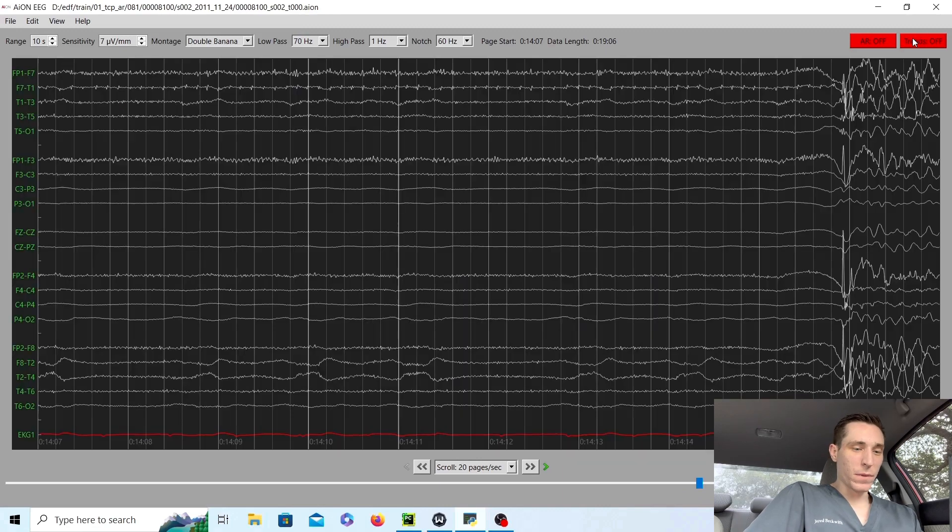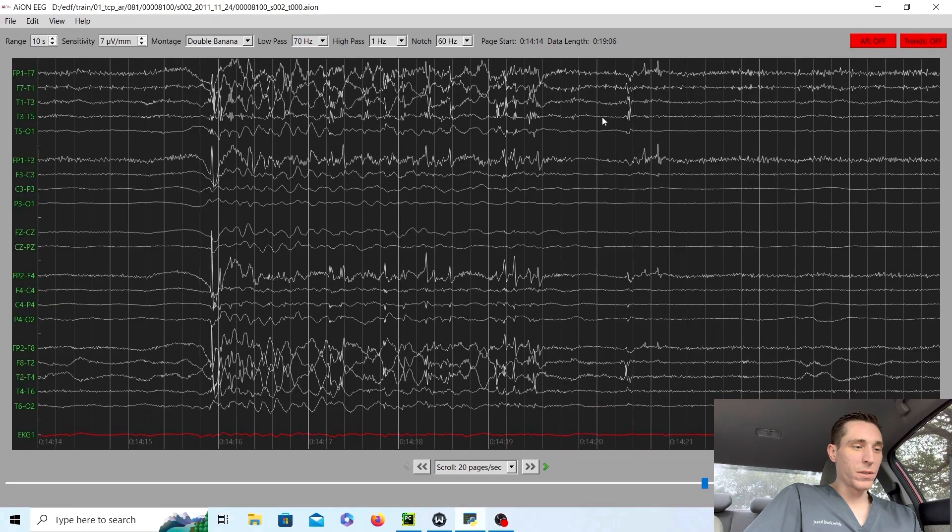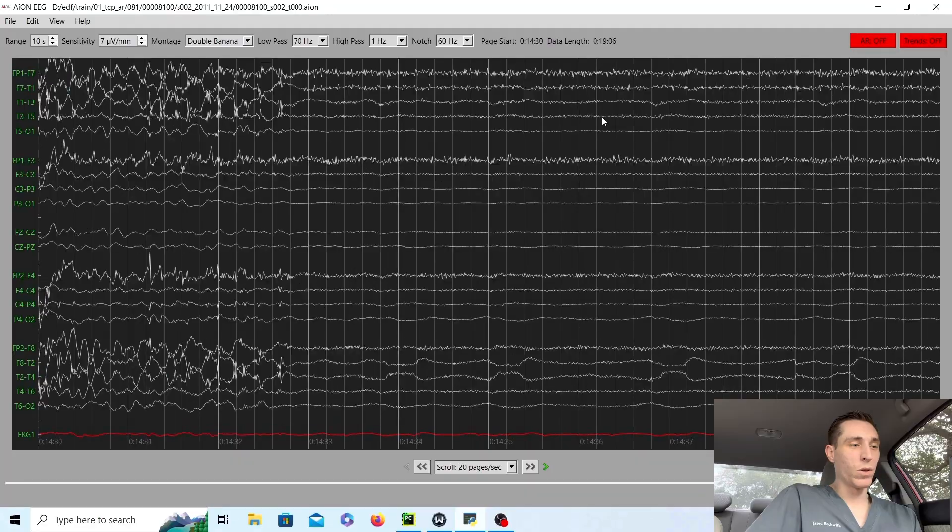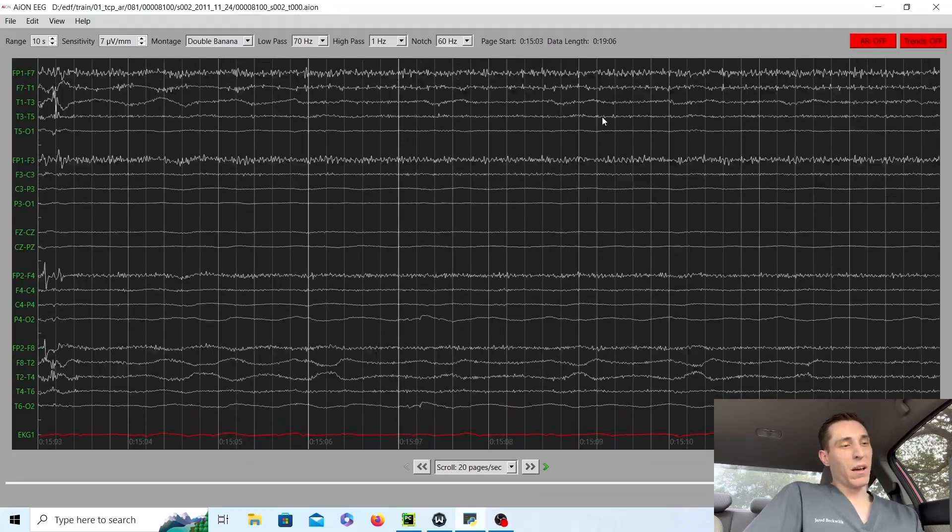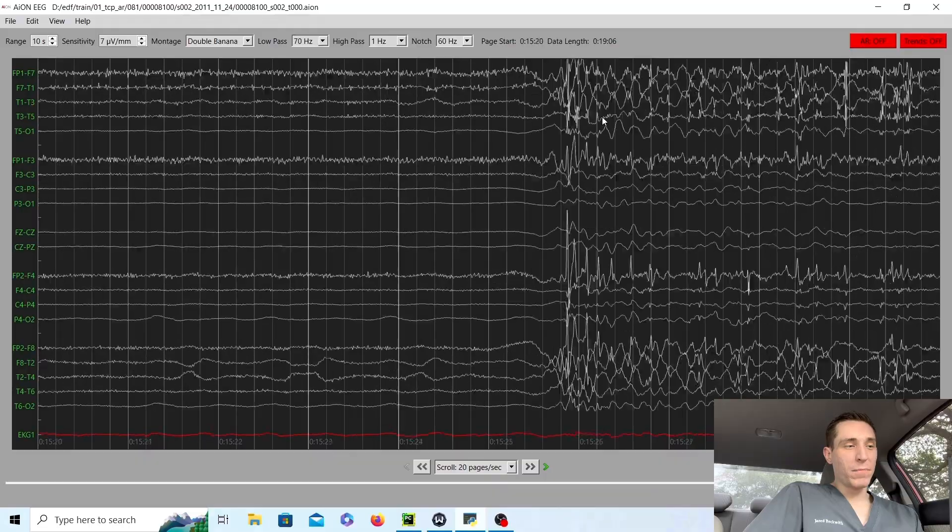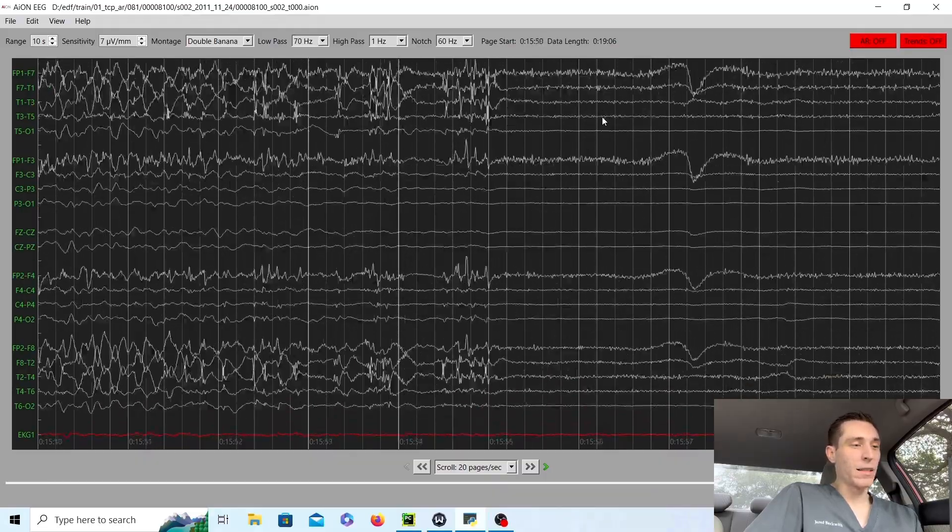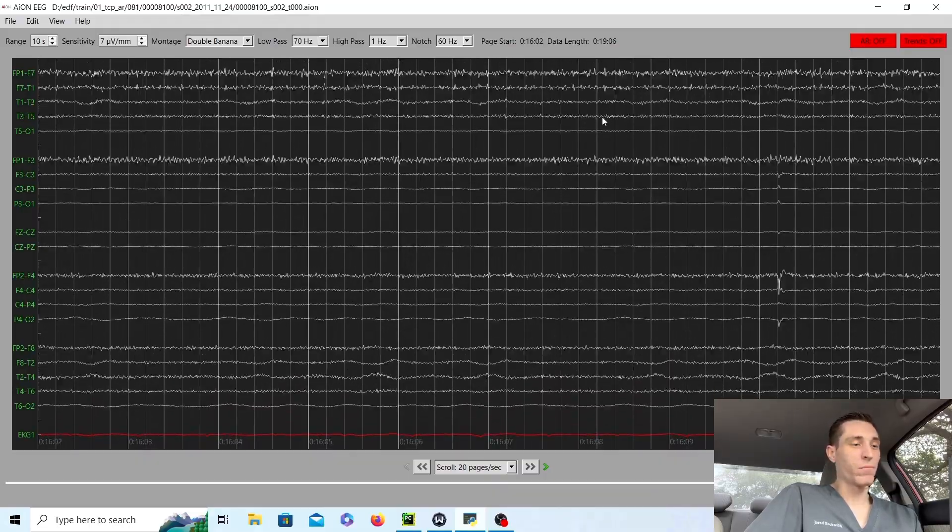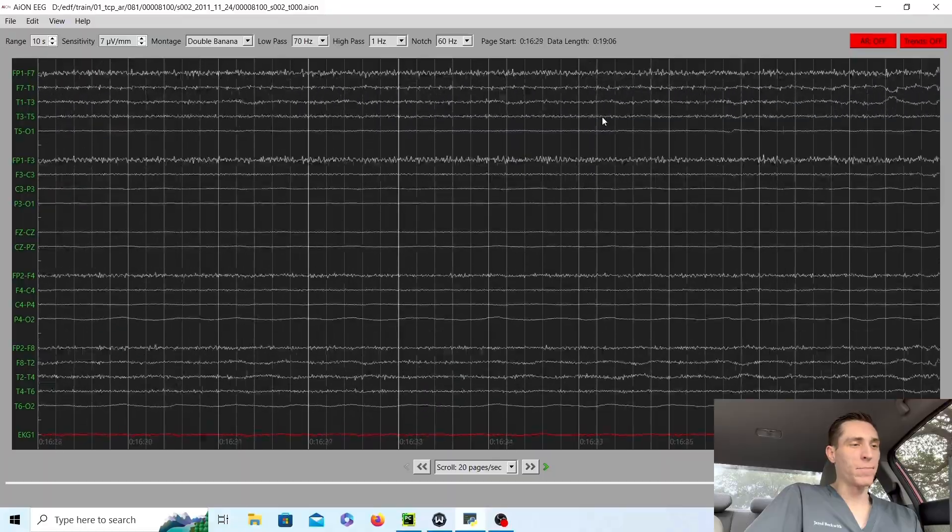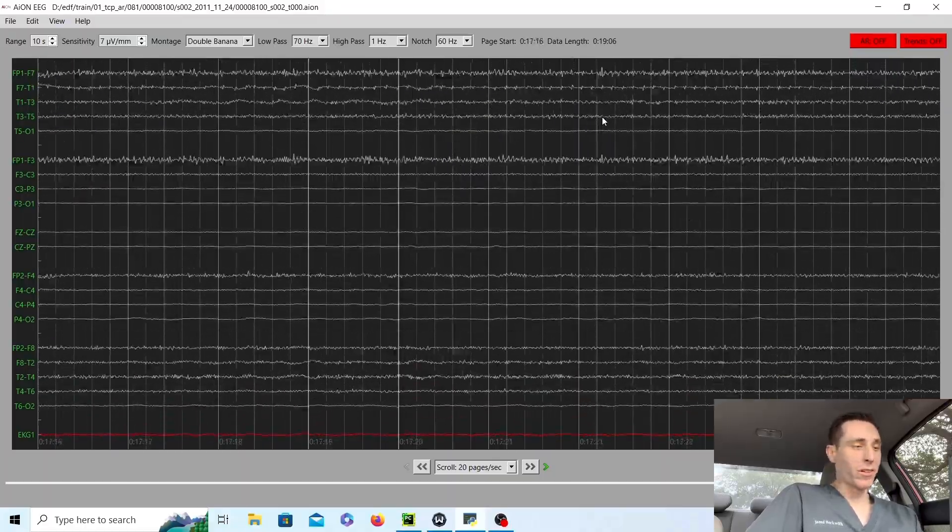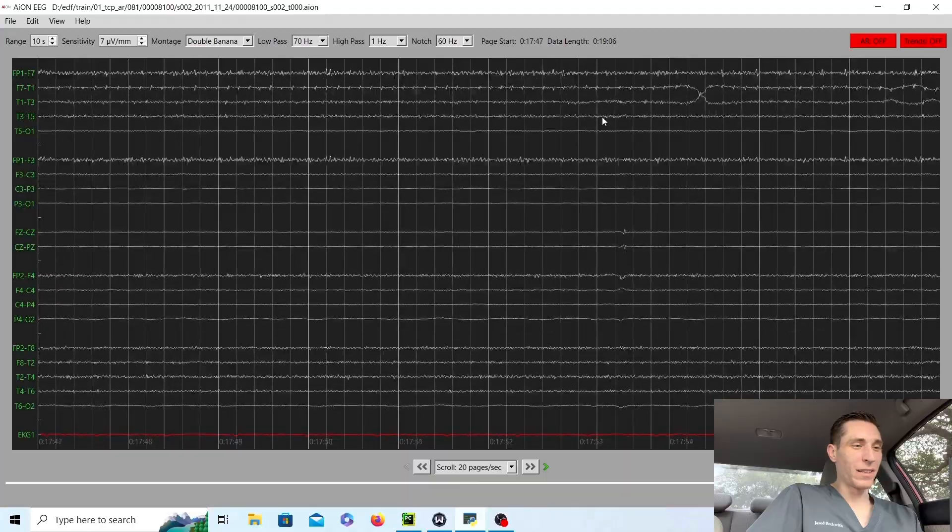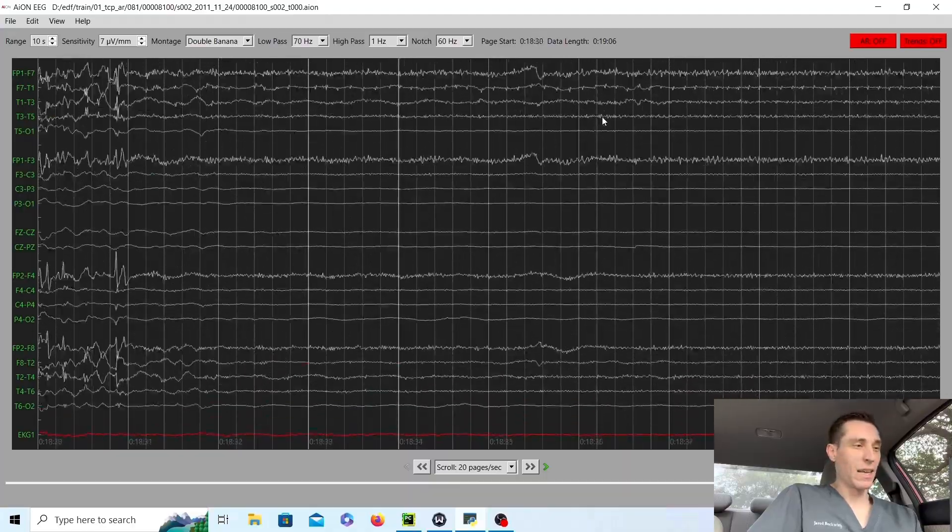Now, if we keep on scrolling, we're almost at the end of the record. We won't see anything other than what we've already seen already. Just a lot of flatline and then a period of quick burst and then back to flatline. And unfortunately, like I said before, there's nothing we can do for this patient except, I guess, pray for them.